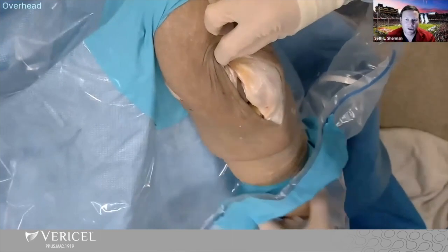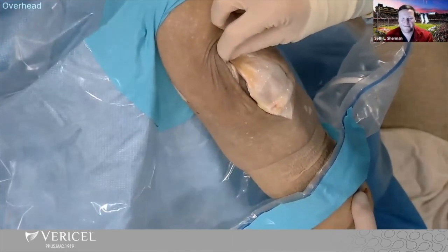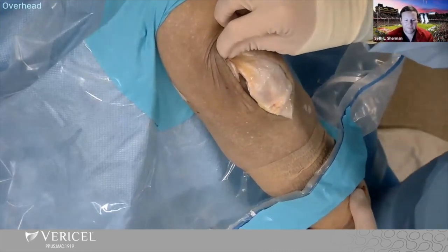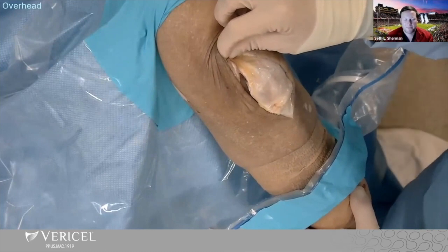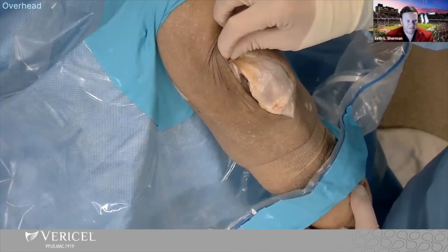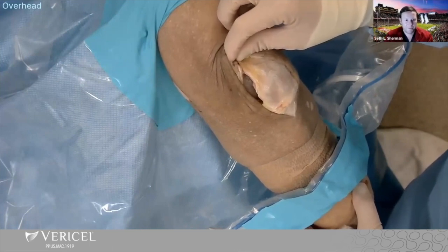How much do you range it in the OR? Zero to 90, fairly aggressively. I'm really aggressive in my patient's motion — I want them at 90 degrees at least by the two-week mark. If they're not, I'm worried, especially with non-osteotomy cases. I want to make sure that implant is going to stay on really well. If I'm at all worried, I'll put a stitch in it. If it comes off here, that's okay because then at least I can redo it.